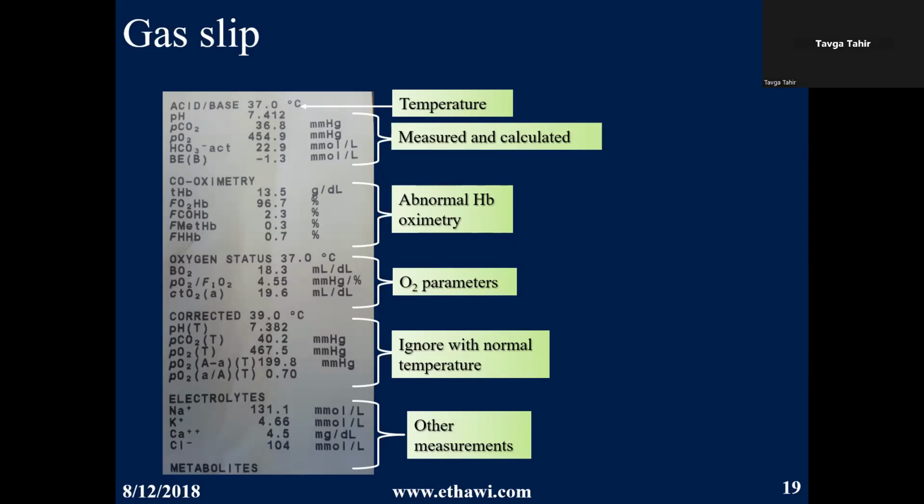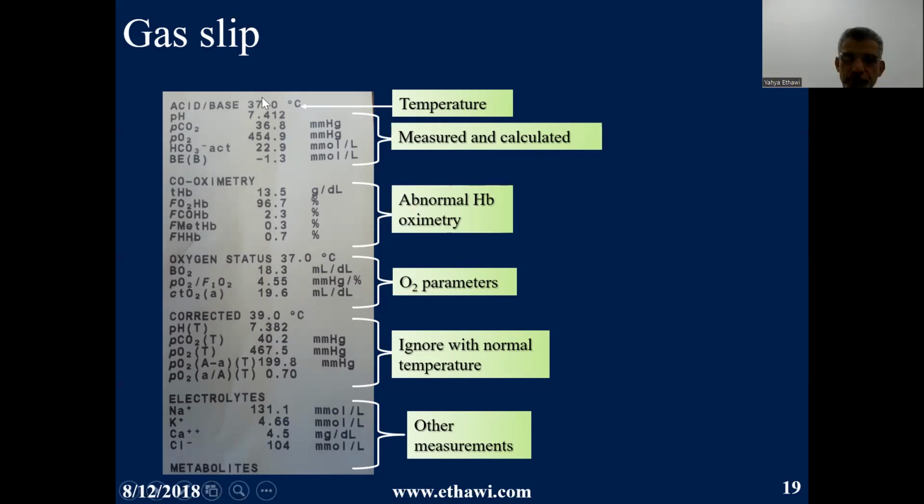Doctor, so what shall we do if there is a difference in the temperature? Either you correct the temperature of the machine and make it the same temperature as the body, or there is an equation that I will provide you to correct the result.